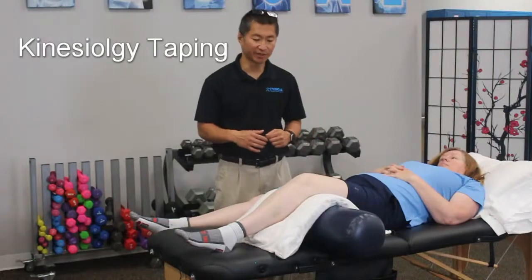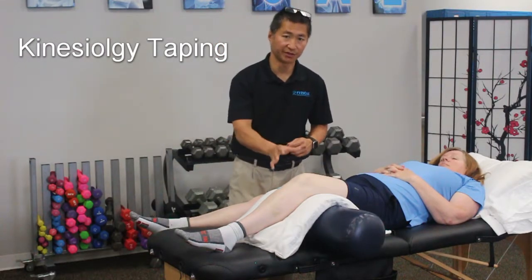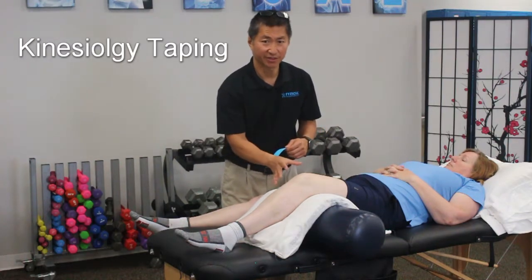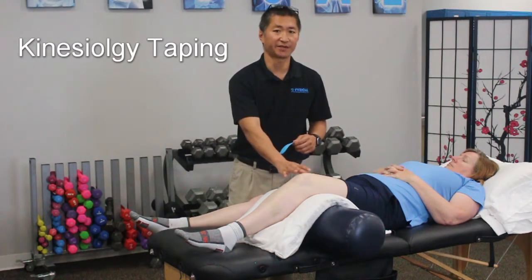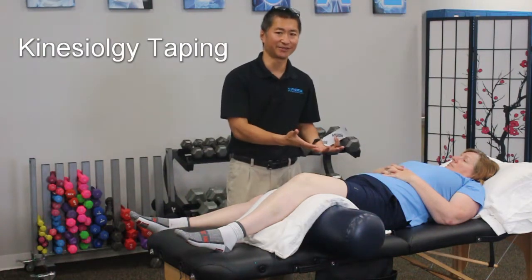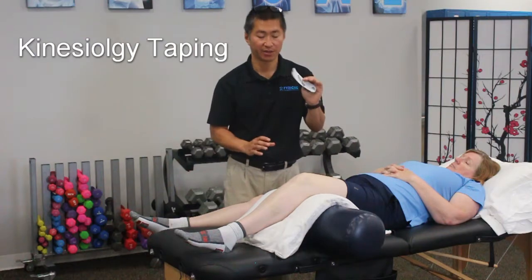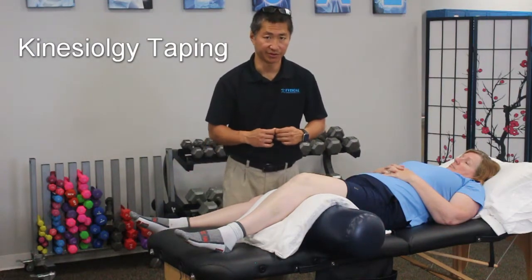All right, so what we're going to do next is, now that we've treated the knee itself and helped loosen the fascia, encourage the healing process, we're going to try and protect Kathie's knee because we know she's not going to be laying like this all day. So we do that through using some kinesiology tape. Our personal favorite here at Physical is Rock Tape.